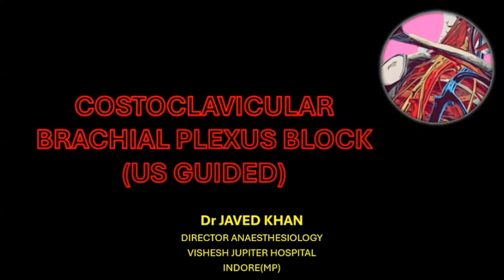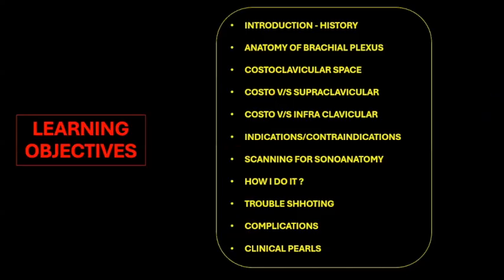I'm Dr. Javed from Indore, and today I will be presenting the ultrasound guided costoclavicular brachial plexus block. These are some learning objectives of this block.